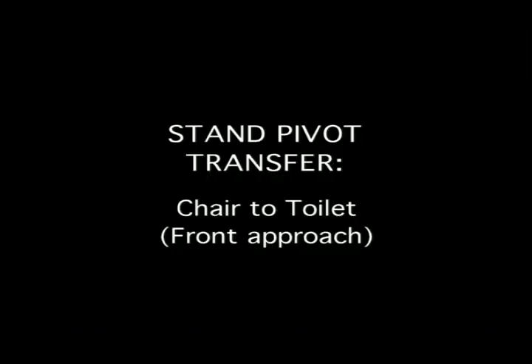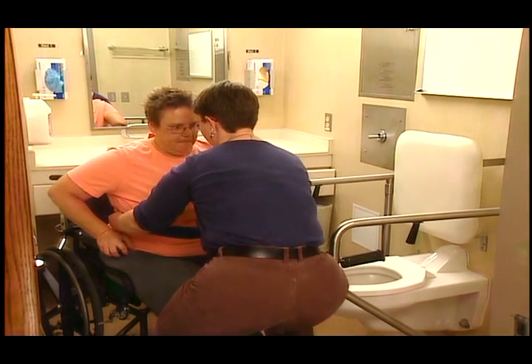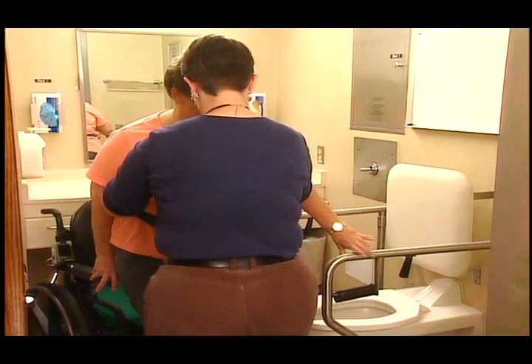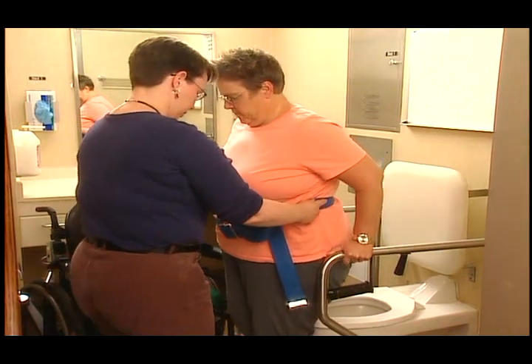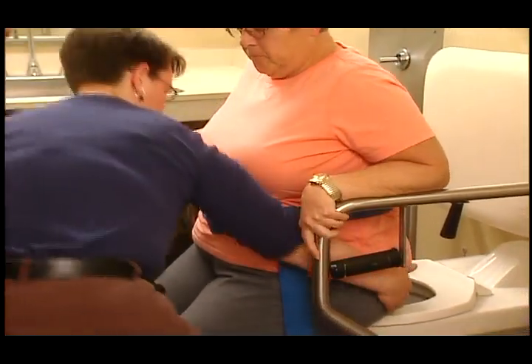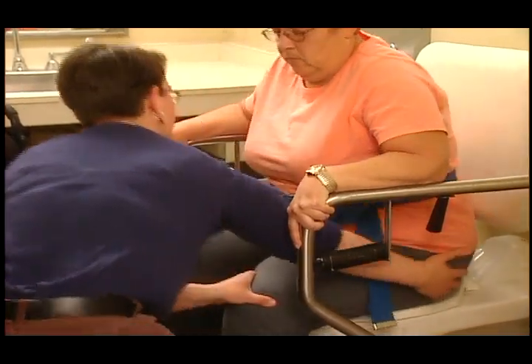This is a demonstration of a stand pivot transfer from wheelchair to toilet. It is performed with the same technique that was just described. Notice that during this transfer, the patient is using her upper extremity strength to push off from the armrests of the chair and gain momentum to perform the transfer. Also observe how the therapist helps the patient scoot back completely onto the transfer surface.